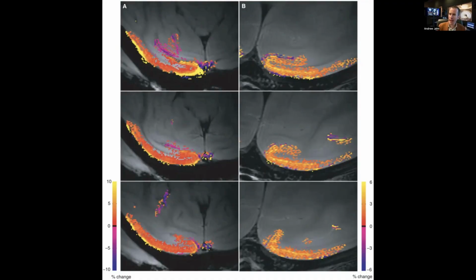Then you apply a refocusing pulse, let's say 180 degrees, like flipping a pancake. Now the faster ones are behind, the slower ones are ahead, and they tend to converge into a signal that averages together, and you're able to get a stronger signal from that. A gradient echo, on the other hand, uses a single radio frequency pulse, but uses phasing and rephasing gradients to then try to establish a stronger signal that you can then acquire.